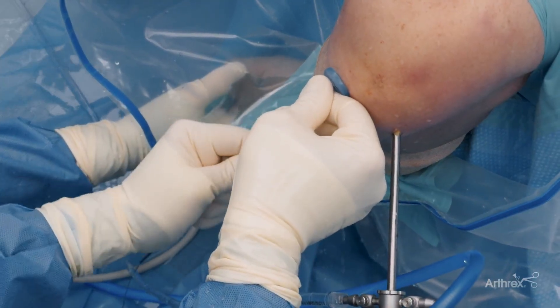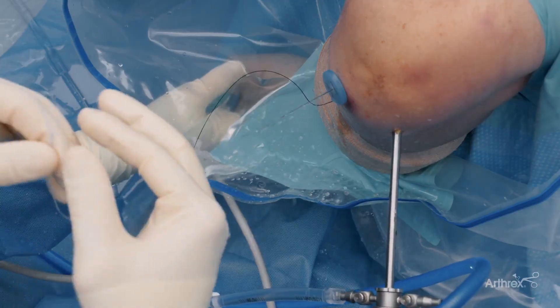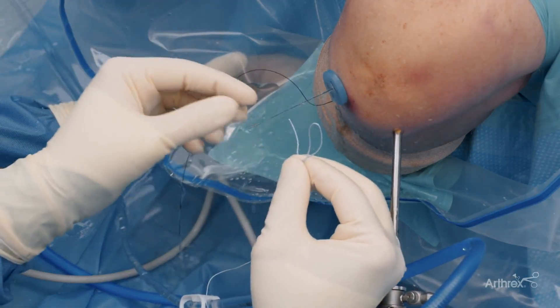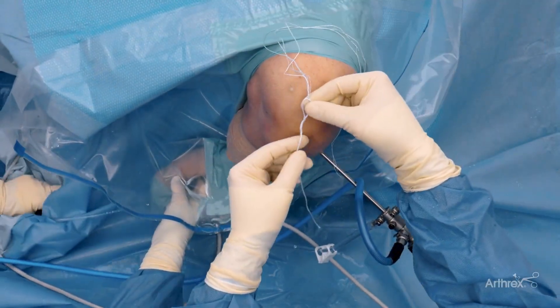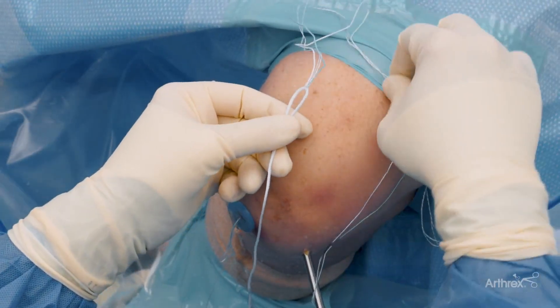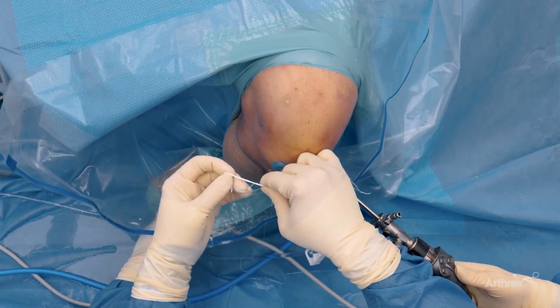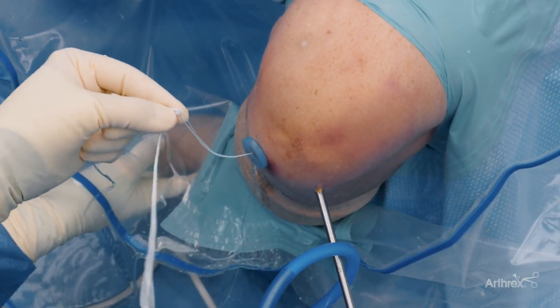We now want to remove the 2.4 guide pin. This can either be done just with your hand or with facilitation with pliers, but you also want to make sure your assistant holds the nitinol wire so that it stays in position. The nitinol wire is then replaced with a fiber link suture, which will then be utilized to pass the SutureLock implant. When passing the fiber link, you want to make sure that the loop stays outside the knee portal and that you pass the single strand down through the tibia. The SutureLock implant is then ready for passing through the passport and down into the tibial tunnel. Keep in mind that these are the repair sutures that will be left coming out of the portal, and we're going to pass this in a retrograde fashion down into the tibia. When loading the fiber link with the SutureLock, you want to make sure that all of the sutures come through and that it comes just past the white end of the sheath. This is important for the SutureLock to be able to deploy successfully and easily into the tibia.